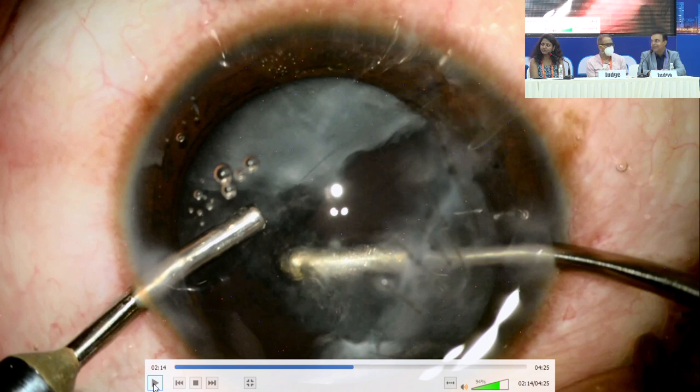They hardly disturb. Have you shifted to the posterior vitrectomy, or are you still using the anterior approach? No, I use my own machines, but sometimes, when we are anticipating more interventions, then we use the Constellation as well, and it works very well. Sometimes I need the light source and other things, and I'll switch to the Constellation. Do you go via the pars plana? Sometimes, yes, as required.